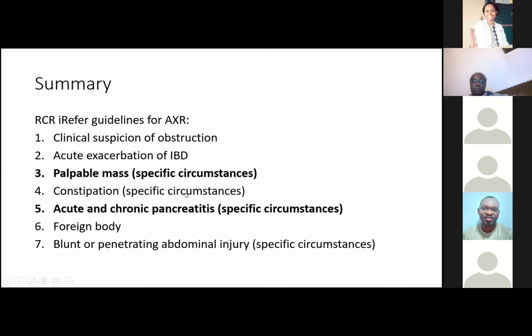One question, okay, maybe two questions. I think I'll need Mr. Adedeji's input on this as well, being a colorectal surgeon. If you've got a patient who's known to have UC and has come with what looks like toxic megacolon, and plain abdominal film is giving features highly suggestive of toxic megacolon, and you think the patient is going towards needing surgery, would you be comfortable operating just with the evidence you've got on plain film, or would you want to get a CT scan?